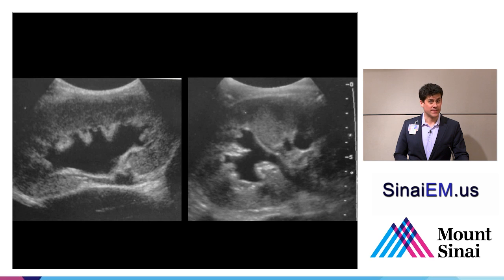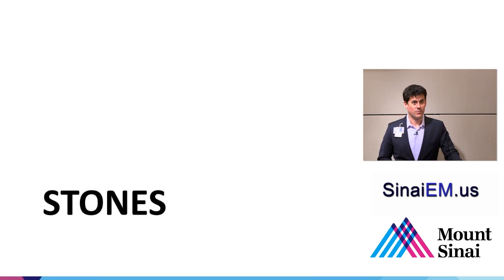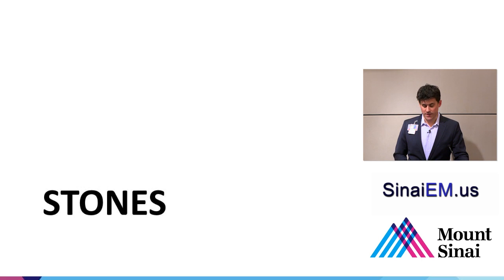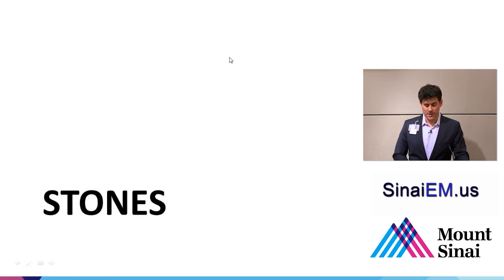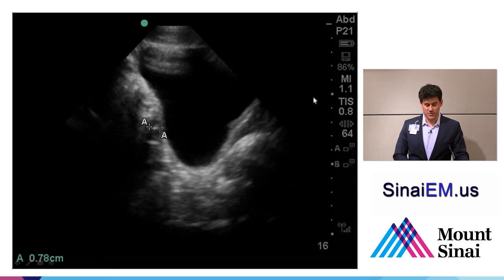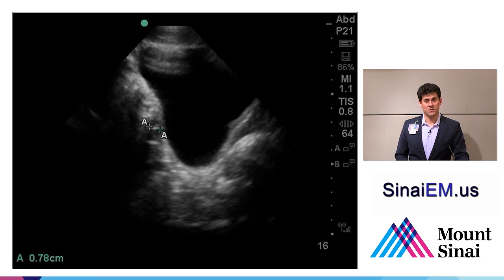Stones can sometimes be seen on ultrasound. One of the more common areas where a stone gets caught is at the UVJ, or ureterovesicular junction. In this sagittal orientation, with superior toward the patient's head, we see a stone measuring almost 8 millimeters — hyperechoic and shadowing slightly — right at that location. In this patient it was associated with hydronephrosis on the right side, very consistent with a diagnosis of renal colic. The ureters themselves are very difficult to see on ultrasound.